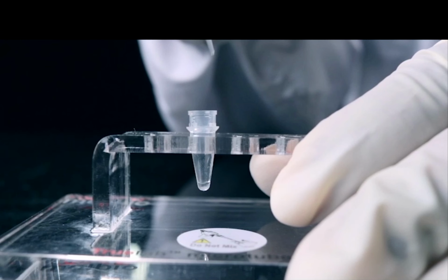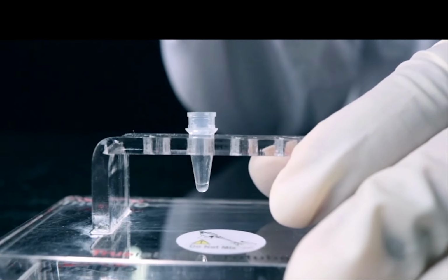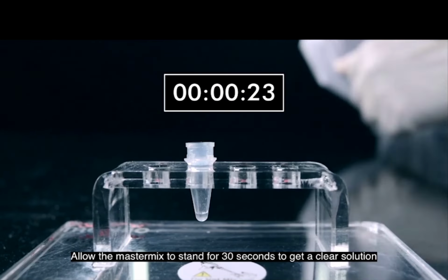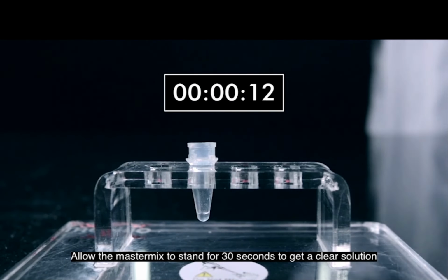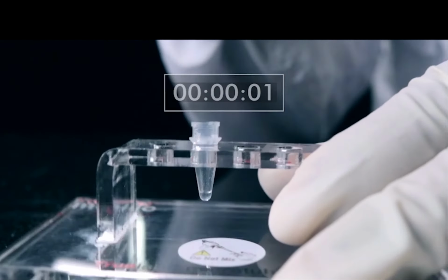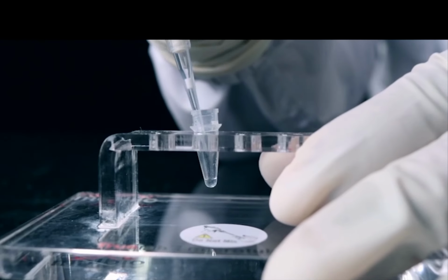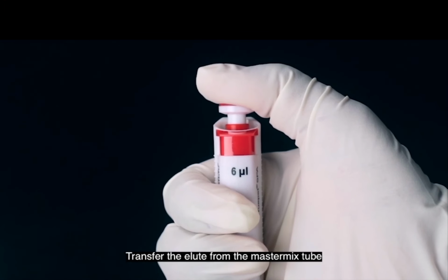Now you have to wait for just 30 seconds. Please just stay there, hold the pipette with the tip in your hand, so that this master mix, the white color thing, will fully dissolve. Just 30 seconds, please wait there, don't discard the tip. Then once 30 seconds is over, press it, then go below the level and slowly take.